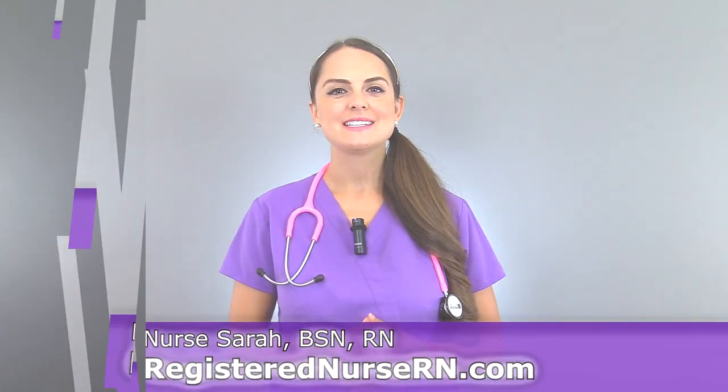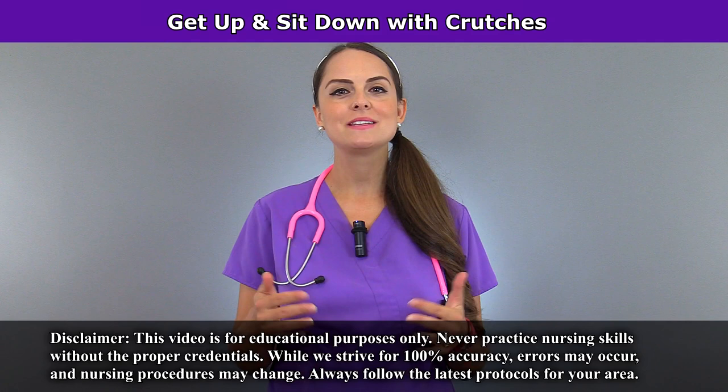Hey everyone, it's Sarah with RegisterNurseRN.com and today we're going to demonstrate how to get up and sit down in a chair while using crutches.